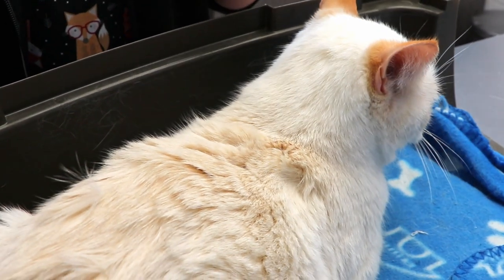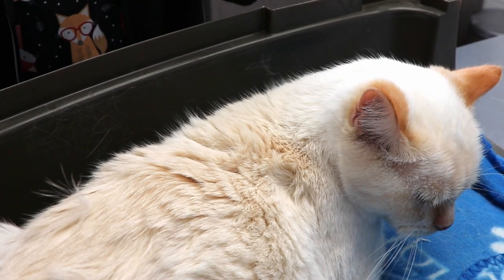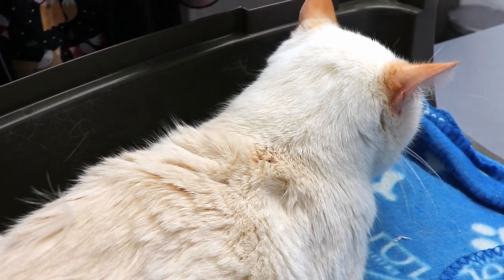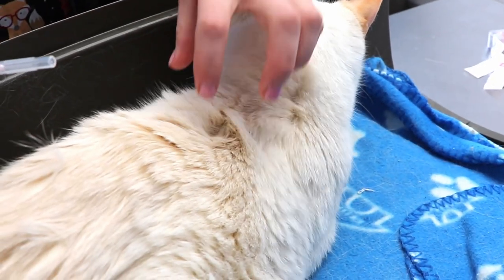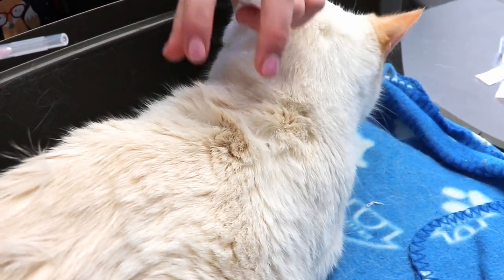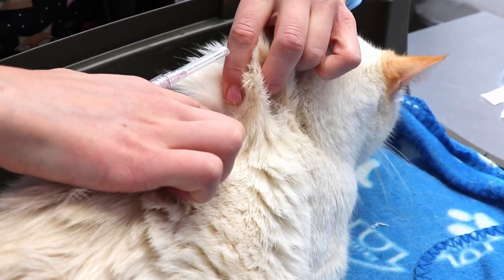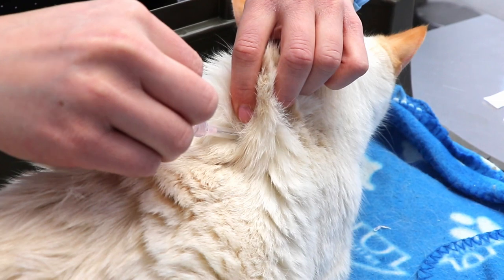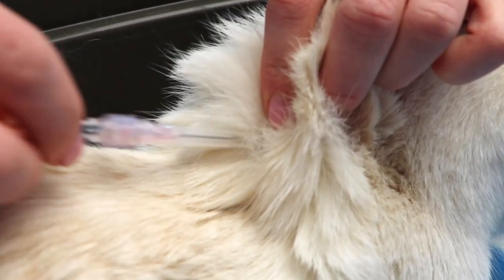Yeah, we dealt with it with another cat — an older cat that needed insulin. Okay, so have you personally given those shots? Yeah. Okay, so you kind of know how to do the injection part. You just kind of pinch the skin — I usually use two fingers here and one here — just to give me a base, and then you go at about a 45-degree angle and just give a firm poke so it goes in there.